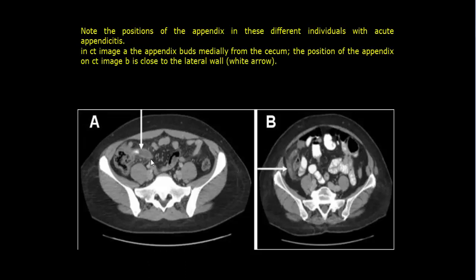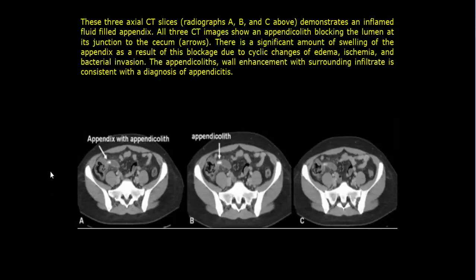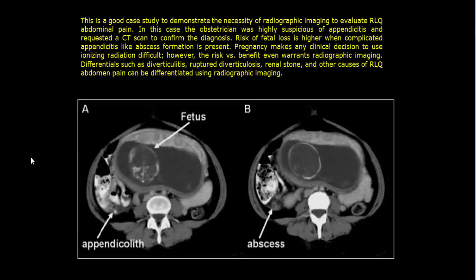Note the varying positions of the appendix on CT: it may project medially from the cecum, or close to the lateral wall. An axial CT image shows an appendicolith blocking the lumen at the junction with the cecum. This is a good case demonstrating the necessity of radiographs to evaluate right lower quadrant abdominal pain. The risk of fetal loss is higher in complicated appendicitis such as abscess formation, as shown with appendicolith and abscess-complicated appendicitis.